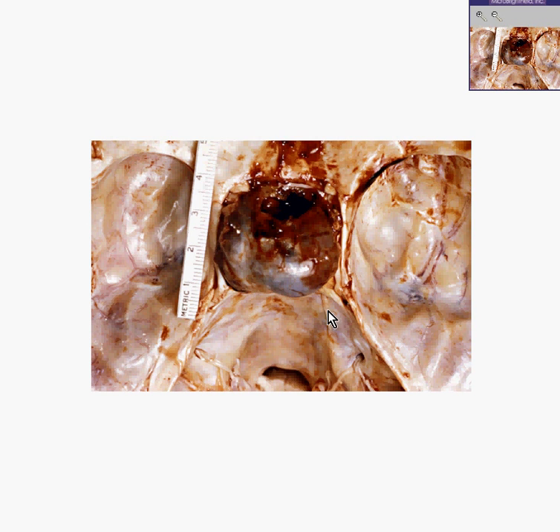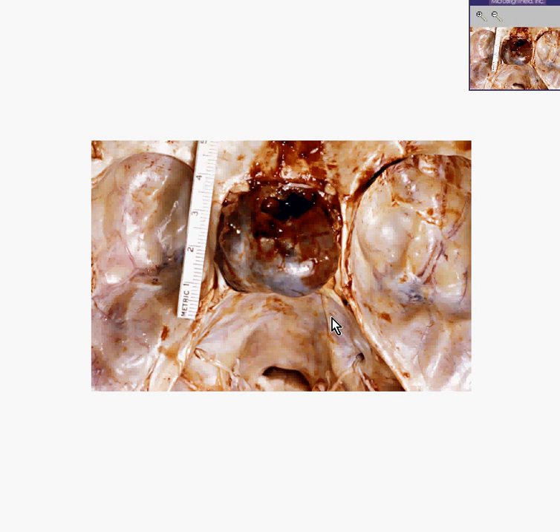On the other hand, this looks like it might be part of the tentorium here, which separates the middle cranial fossa — in which the temporal lobes lie — from this posterior cranial fossa, which the cerebellum lies in. And I believe I would probably call that the foramen magnum.